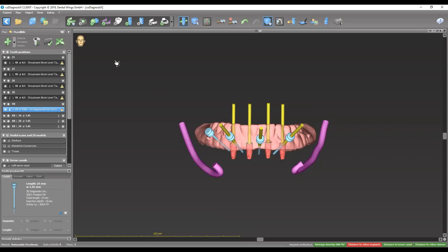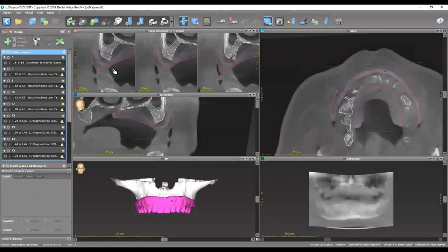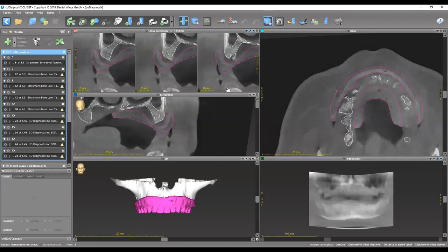We also have another arch — the upper arch — and we're going to plan it basically the same way. The only difference between upper and lower arches is the vital structures and anatomy found in each arch. For the upper arch, the absolute minimum according to literature would be around four implants. That's completely different from the mandible — in the mandible, two implants at the corner of the mouth can be enough because the bone is denser, whereas the upper arch bone is a lot softer, so four implants is a better absolute minimum.